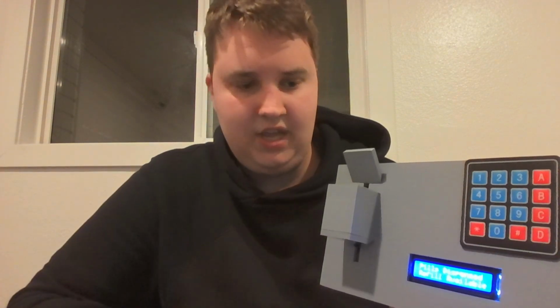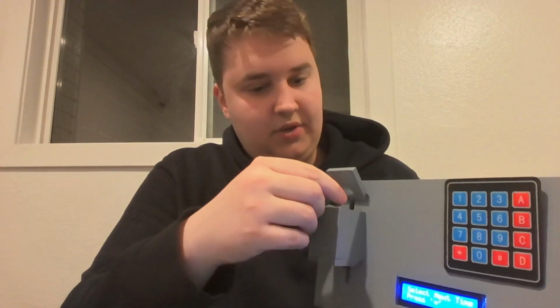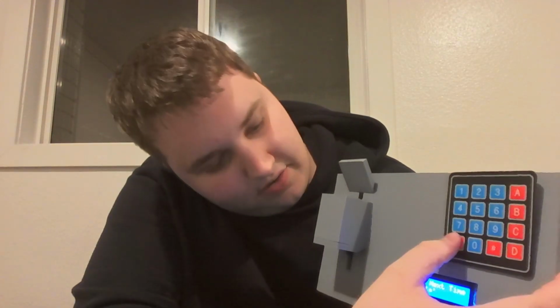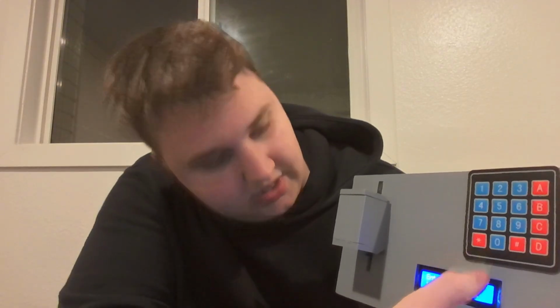Now that the buzzer has stopped playing and the break is done, it now says that we can press pound to continue. So once a user is here and ready to keep going and insert the next pills, they press pound to continue. It closes the bottom, opens the top, and now tells the user that it is available to refill. So add more pills in to allow the process to keep going. So we add our dongle back in. Now if we press asterisk, it will take us back to the time selection screen and we can begin the process anew. So now it says time input mode and we're back exactly where we were.